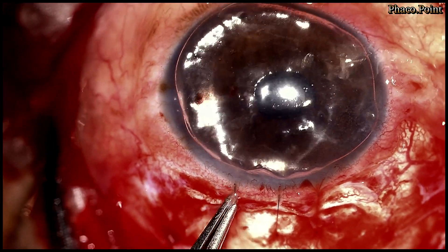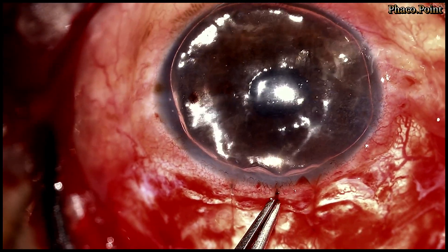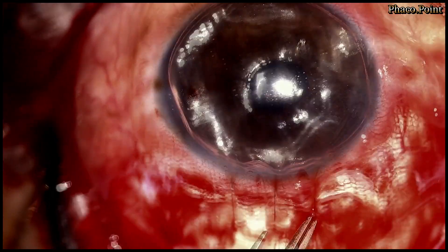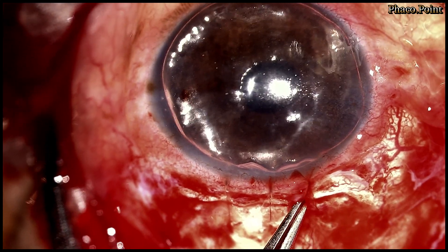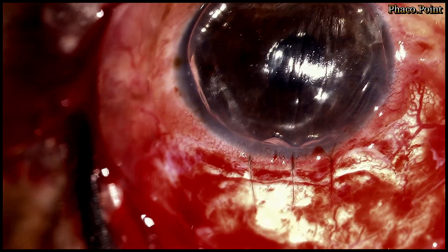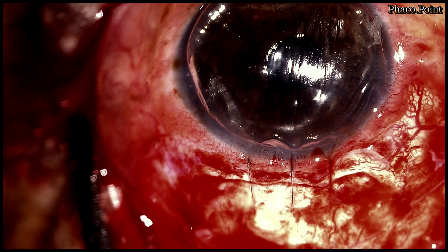This is followed by the burying of each of the sutures. In order to bury it, the eye is pulled upwards while the suture is buried in the direction of the cornea. And this, as you can see, is the end result of the perfect suturing of the SICS tunnel.